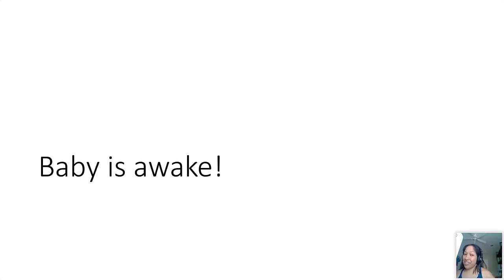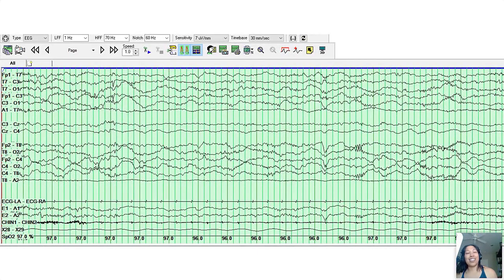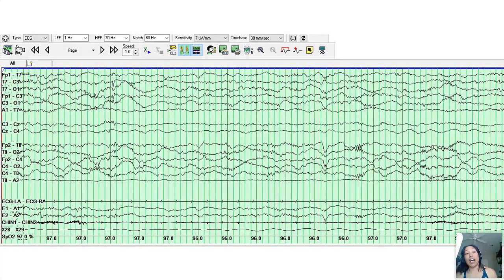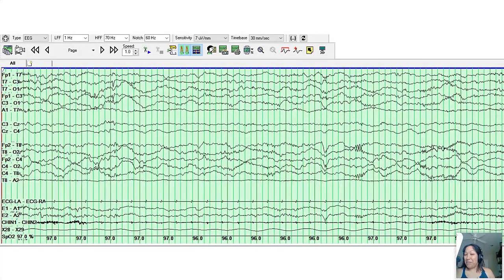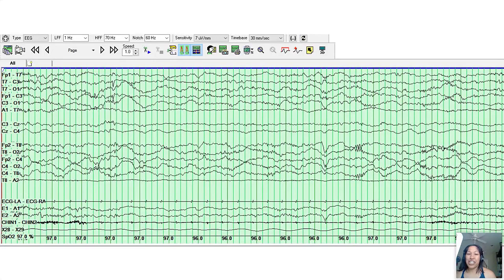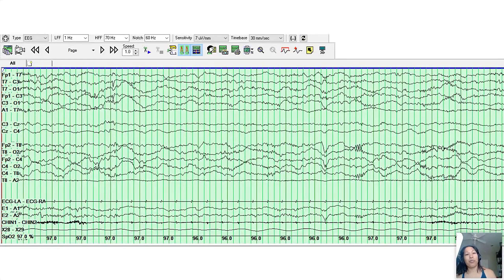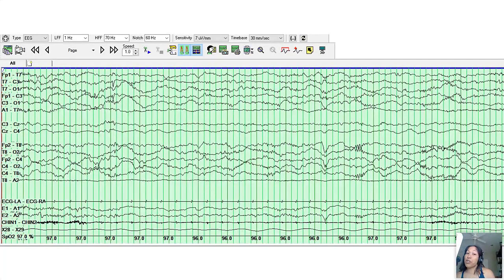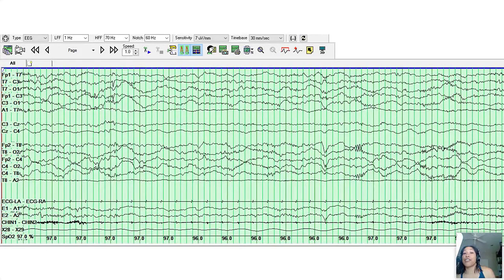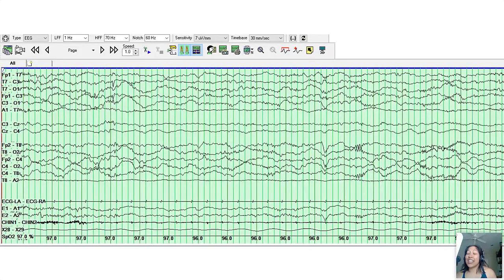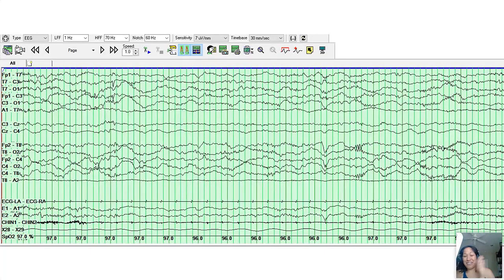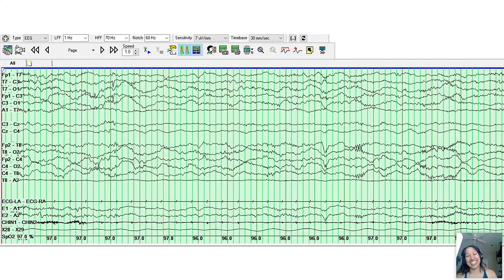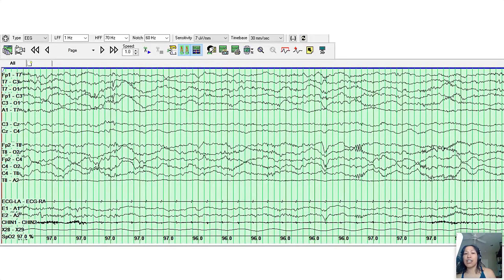Next let's look at an awake tracing from a neonate. And what I want to stress here for our techs and for our non-pediatric epileptologists is in an awake tracing of a neonate we're not going to expect something that looks like a PDR, a posterior dominant rhythm. We're not really going to expect an anterior to posterior gradient. The PDR is something that you'll start seeing maybe at around three months of age or so. And I say this because this is not necessarily obvious.